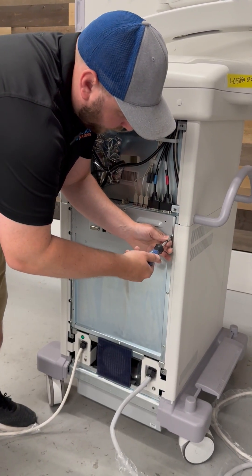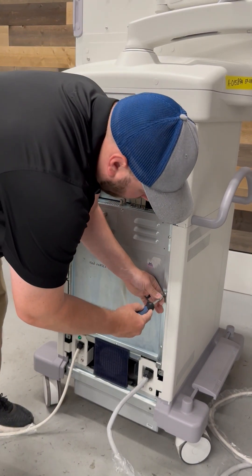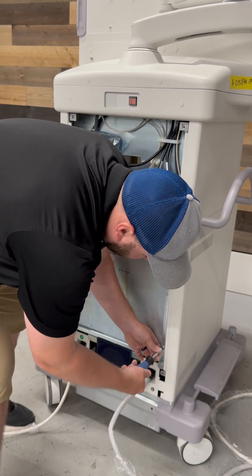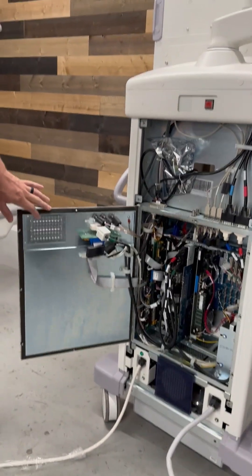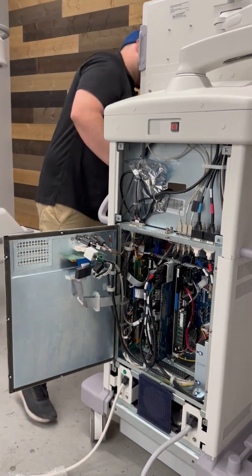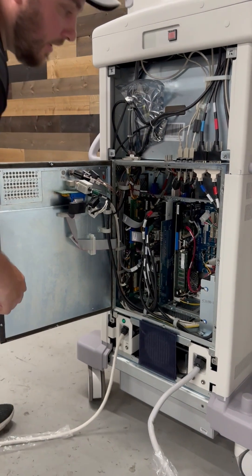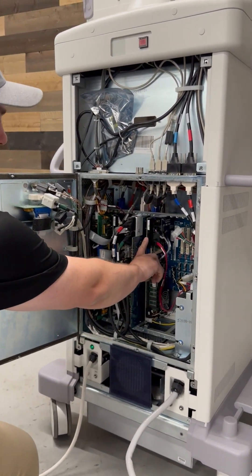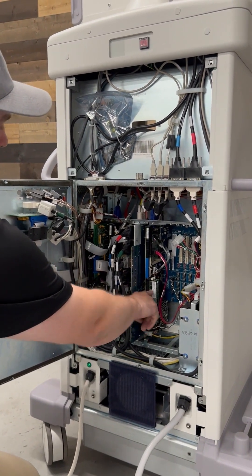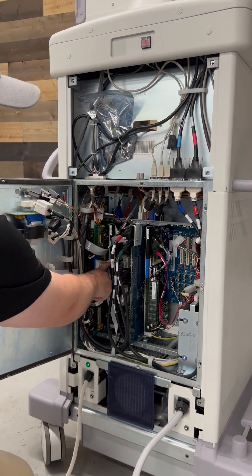These are just quarter turn screws. Now we have the inside of our workstation exposed, and on a 9900 you're going to have two single board computers. The one on the right is going to be your GPOS and the one on your left is going to be your RTOS.